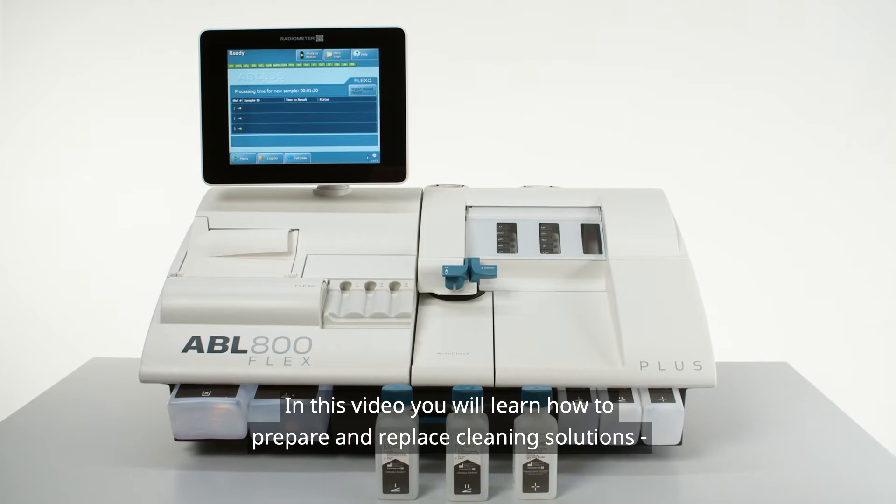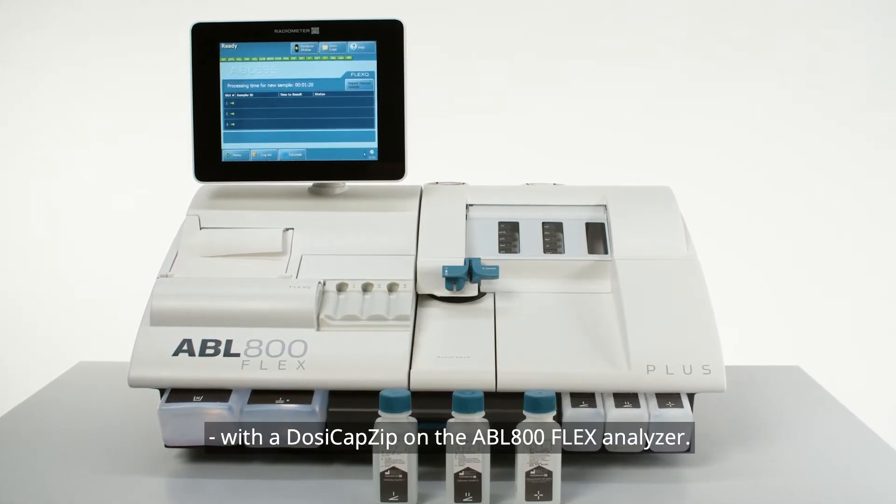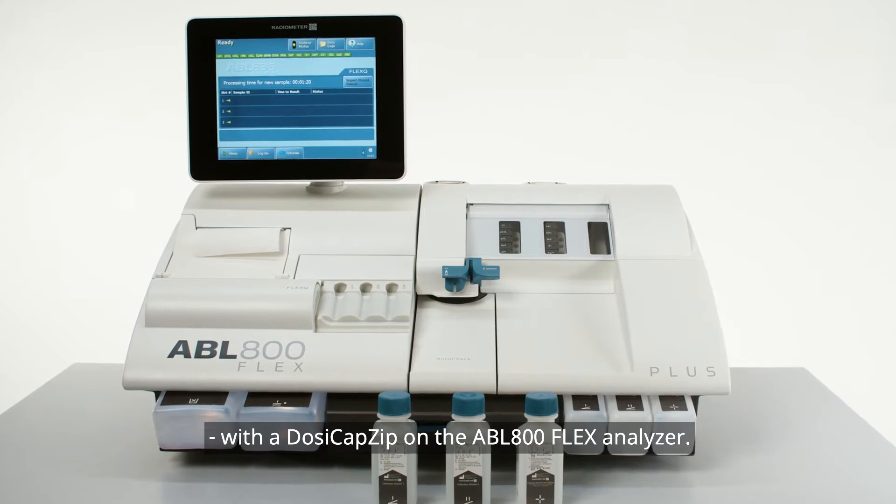In this video, you will learn how to prepare and replace cleaning solutions with a dozy cap zip on the ABL 800 analyzer.